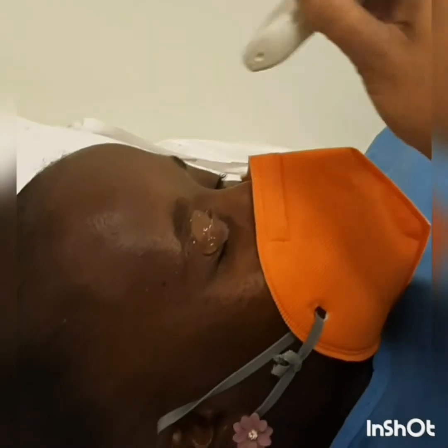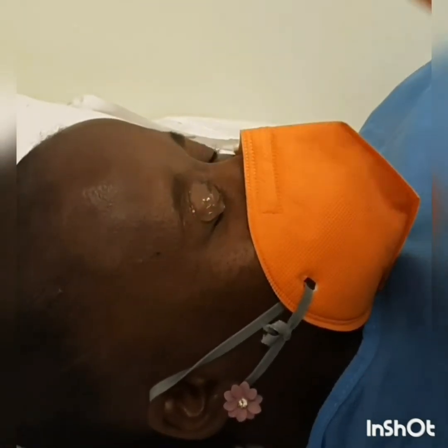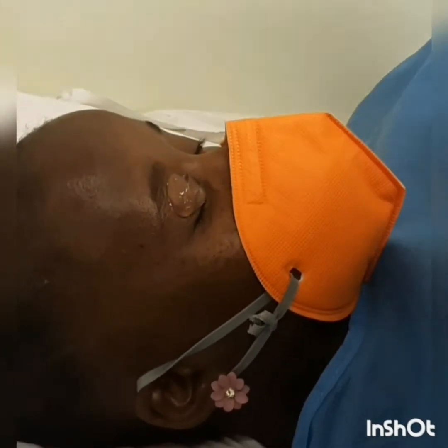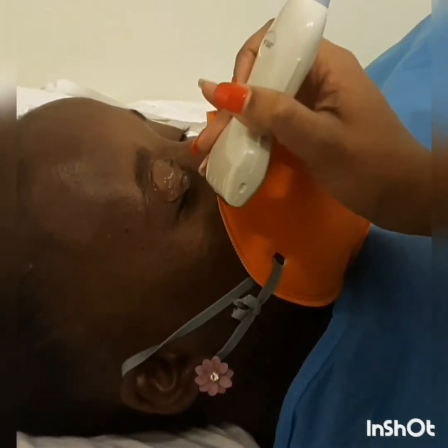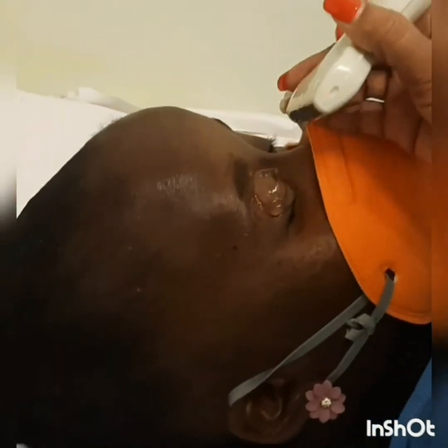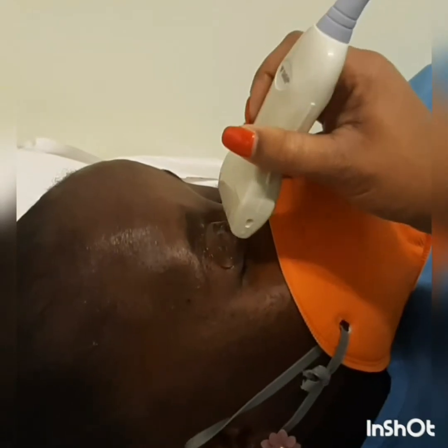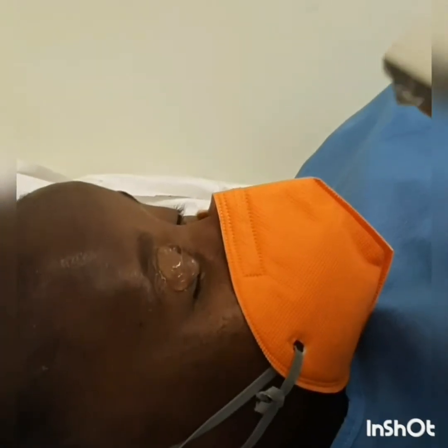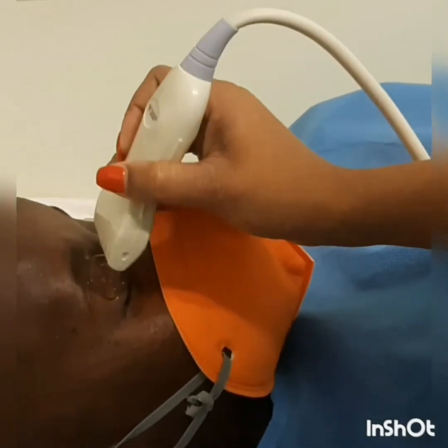You do the scan in both transverse and sagittal. You're first going to start in transverse. You can have your pinky resting on the nasal bridge of the patient. Just make sure not to cut off the patient's breathing. Your probe marker is going to be on the patient's right, like we usually do with other examinations.